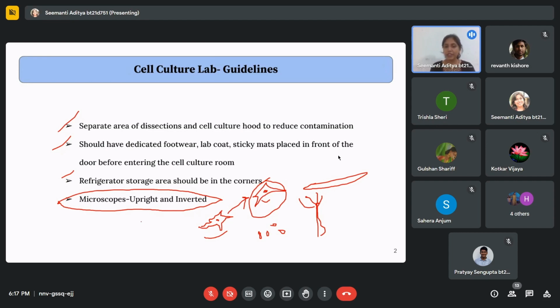So bacteria, different shapes are there. As you all know, there are coccus, which are round shaped bacteria. There will be rod shaped bacteria, which are rod-like in nature. And then there are spiral shaped bacteria, which are spiral. So this kind of bacteria we can see in the cell culture under the microscope, where your cells will appear very big and your bacteria will appear like small dots outside the cells.